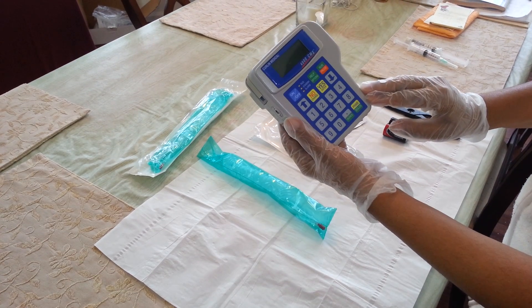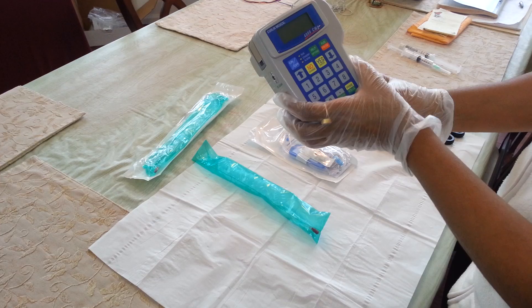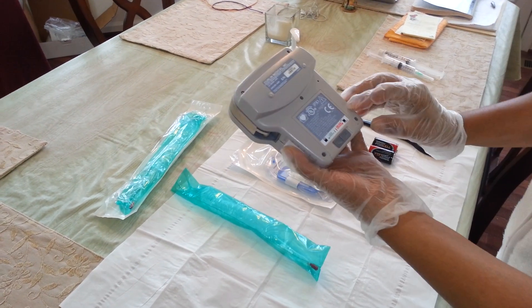This is what the Curlin pump looks like. Before putting in the tubing, I am going to put the batteries in. This is the back side of the pump.